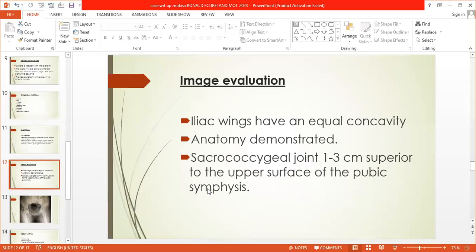You have to be very careful not to collimate out of the anatomy. Either you might reduce the collimation or increase the collimation. When you increase the collimation, you are going to have an image with scatter. Even you, the radiographer, you'll be damaging yourself. You would have disobeyed the ALARA principle, which was stated by the Uganda Atomic Energy Council.